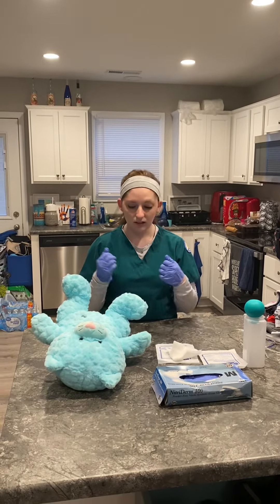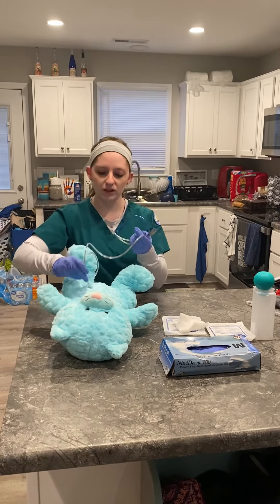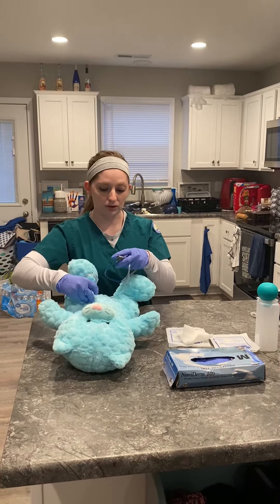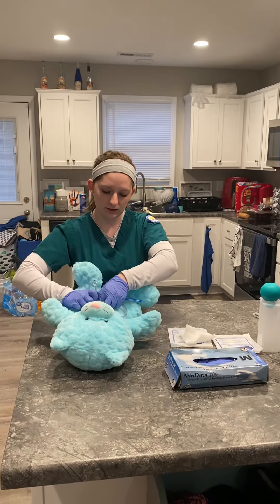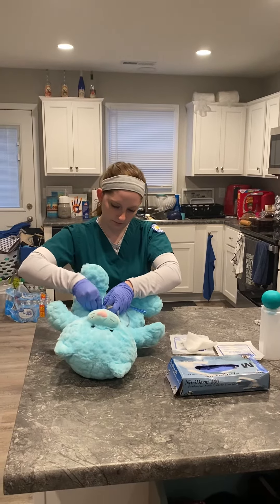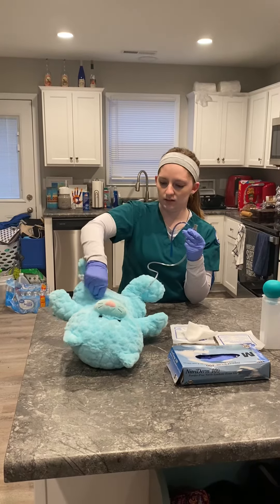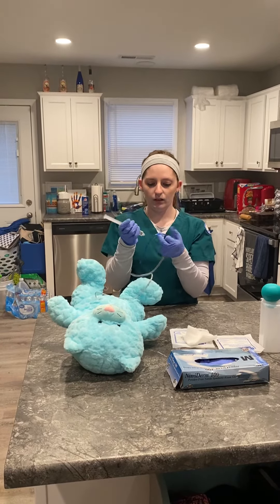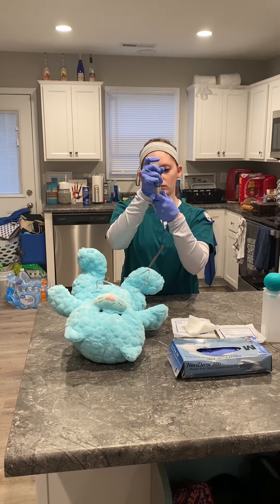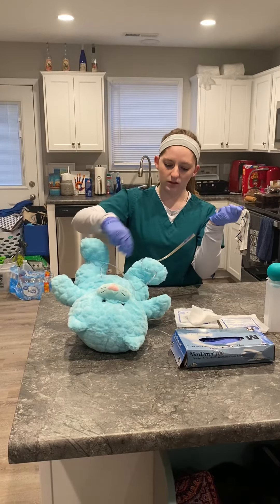Now that I've cleaned the area, I grab my new tube and place it two to four inches into my patient. Now that I've placed it two to four inches, I'm going to inflate the balloon, then tug to make sure it's in there properly.